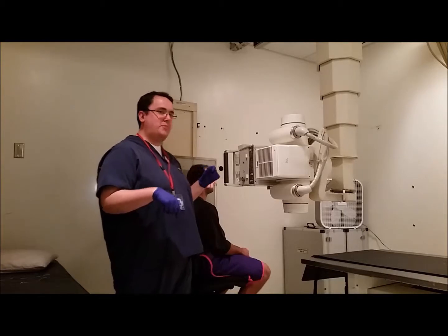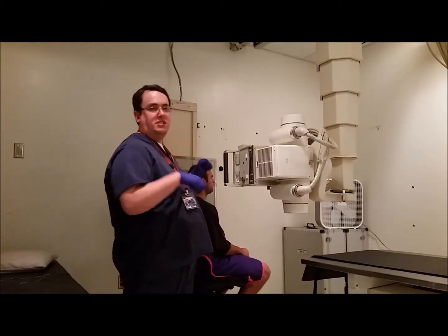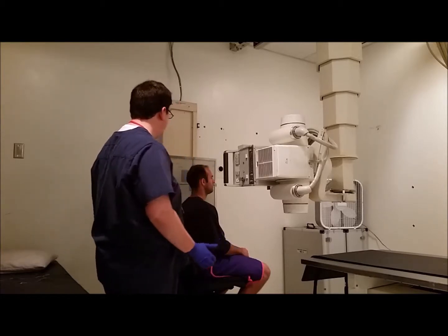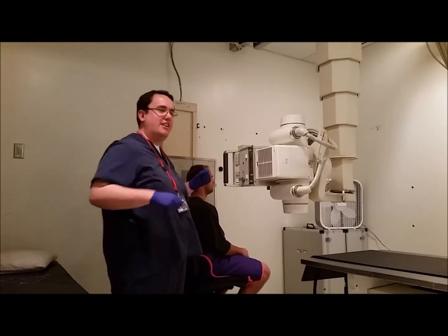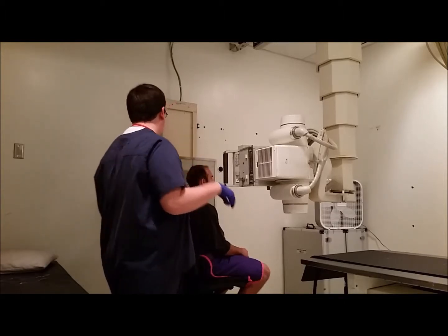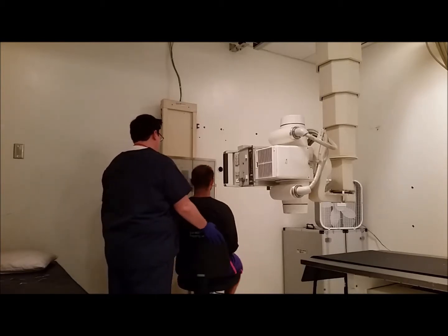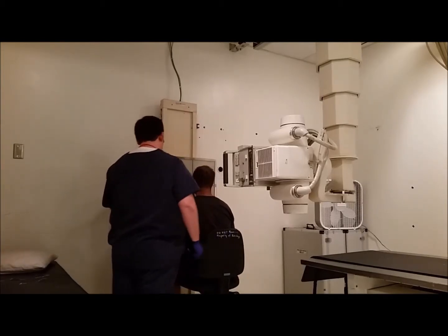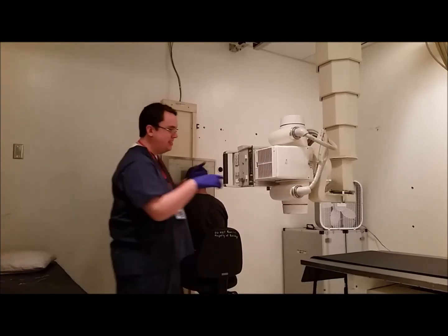Alright, we'll take our first image. It'll be about 70 at 8 for a lateral view, a bit less than all of our other views. So hold your breath, click, take that first image, take out the IR, run it, do our second one here, which is the water, sorry, the Caldwell. So have you turn and face the board here for this one. Move up as close as you can up on there. You're gonna have your nose and your forehead pressed up against the board.